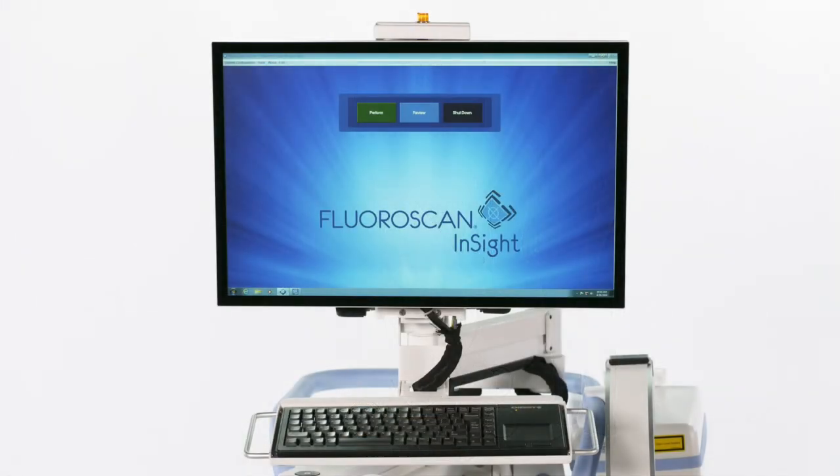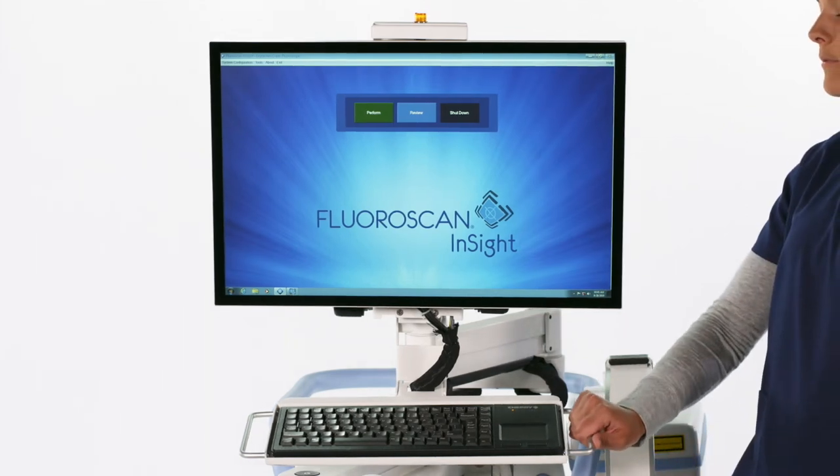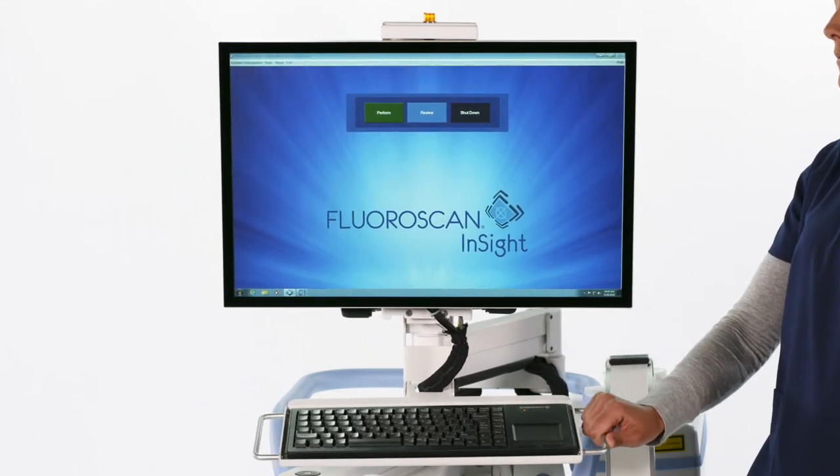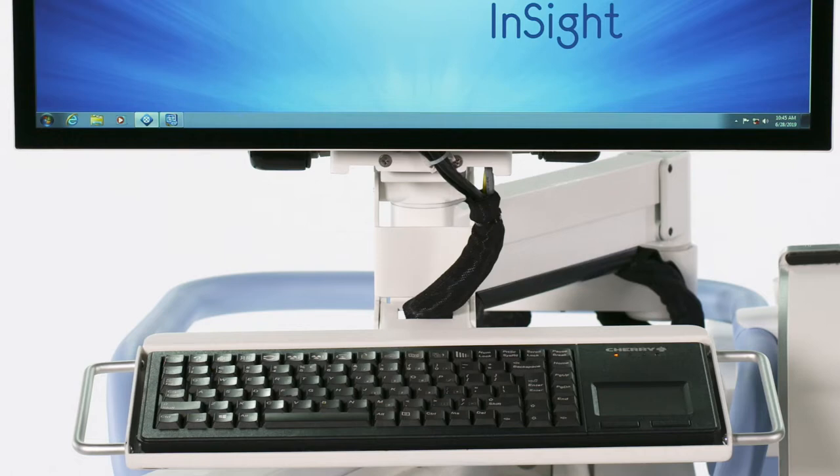The monitor is a 24-inch HD color touchscreen that can be pivoted and tilted for use. There are handles to help with repositioning the monitor. The keyboard with operating controls is directly mounted on the monitor.